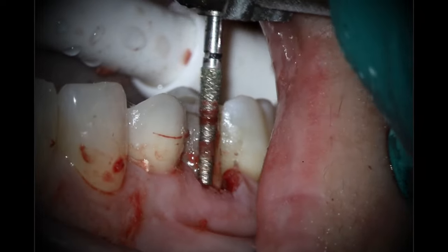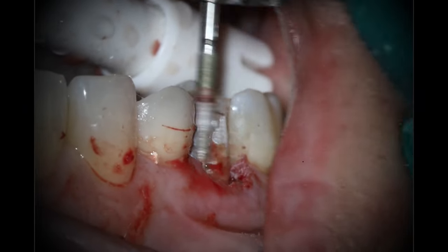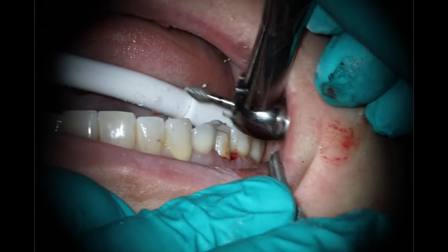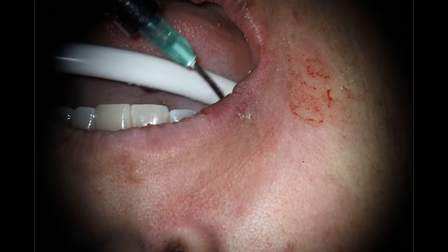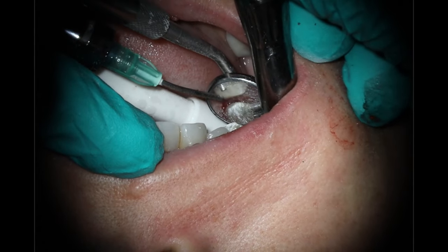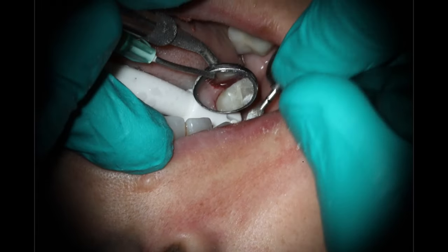My goal has always been to take care of patients and make the general dentist's life as easy as possible. Going with the barrel burr to smooth off any sharp edges and to create the central groove. I don't want this tooth to be hitting at all because it was already broken down — don't want to cause any more trauma. It's going to be fine without a temp for a few days. She was scheduled a week after, which gives the gingiva enough time to heal, and then they can do the crown on top and everything should be good.